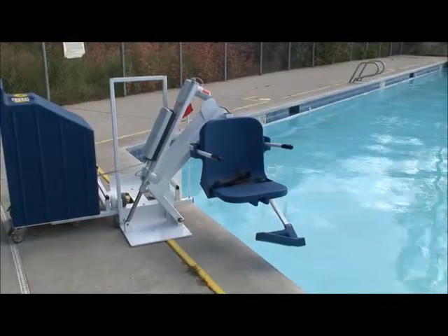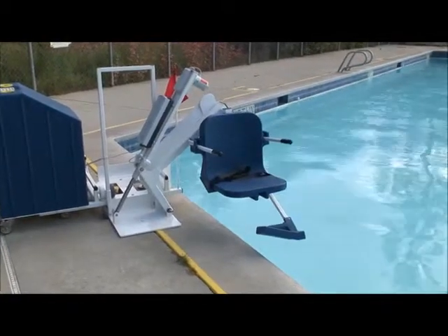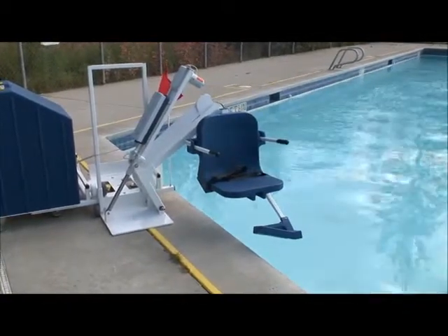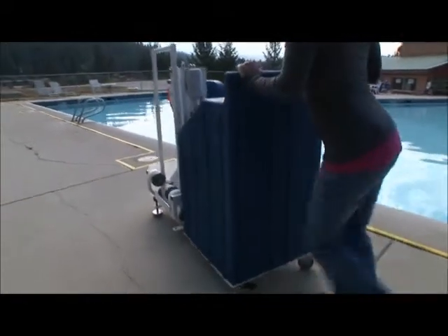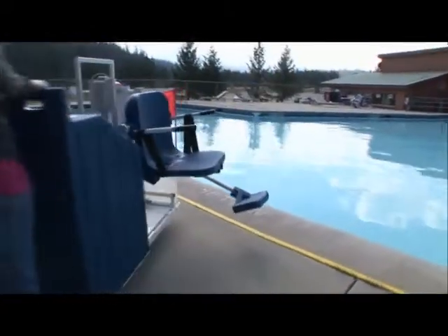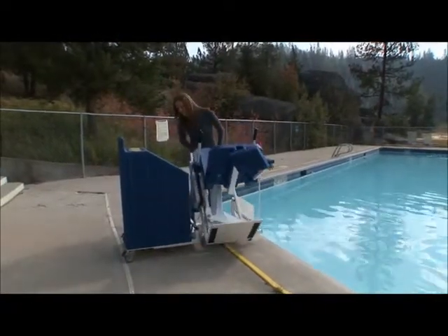The Patriot lift provides those with mobility issues the freedom to enjoy their pool and spa with the convenience of this anchorless model. It's ideal for situations where anchor installation may be an issue. The Patriot is verified ADA compliant when utilizing our fixing kit that comes standard with all Patriot lifts.